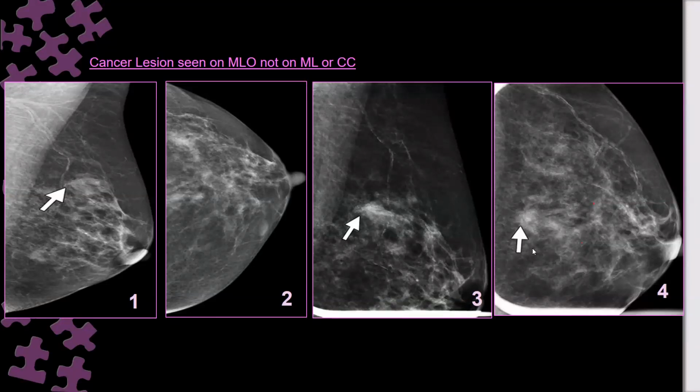This is again a spot view, but of the extended lateral view. Since the lesion is seen here at the parenchymal apex, that means the axillary tail. And clearly the medial breast is well pulled in at the expense of the lateral breast. So from this image I expect the lesion to be in the lateral breast.